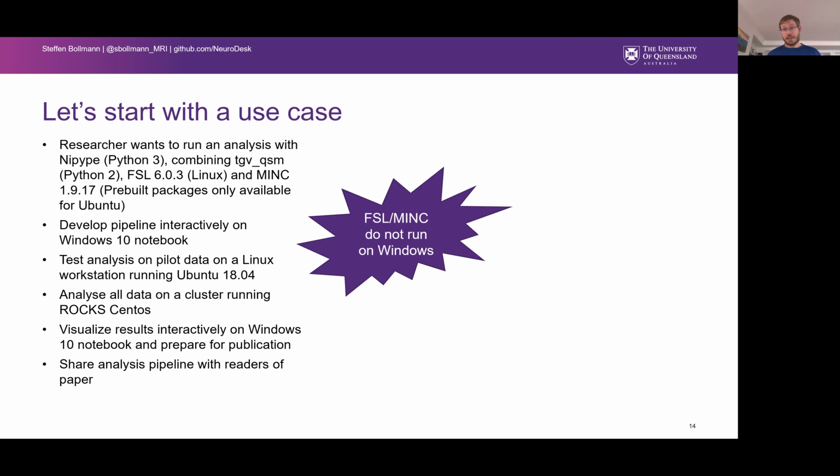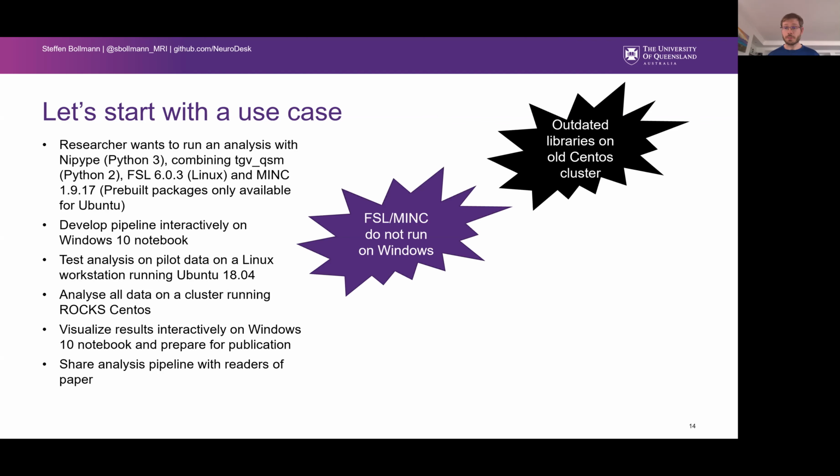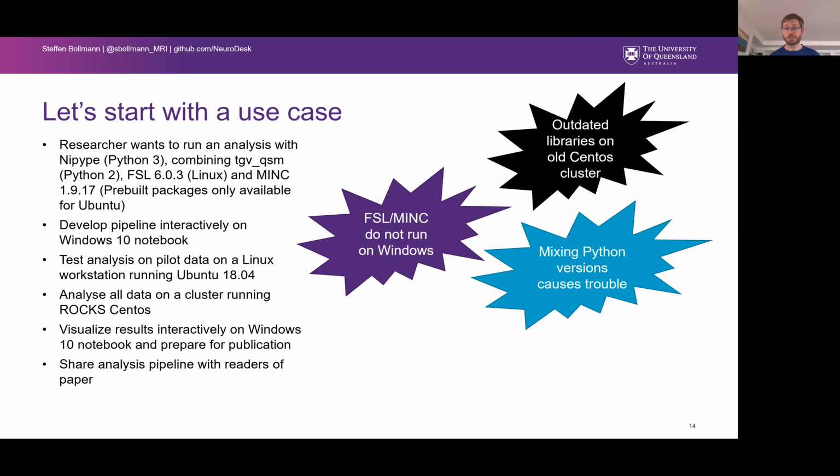The problem is that the researcher will run into a lot of problems trying this. So first problem is FSL and MINC just don't run on Windows. Bad luck, they're Linux tools. When trying to install these on the old CentOS cluster the researcher has access to, there are outdated libraries and it's very difficult to compile the tools on them.